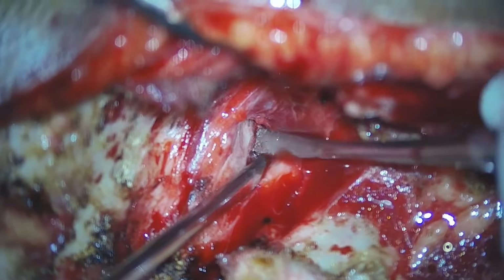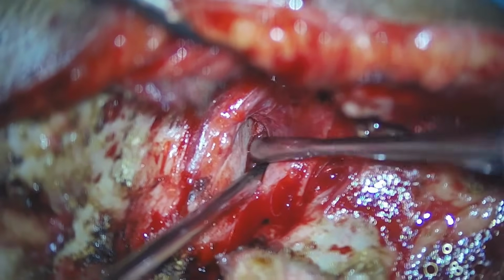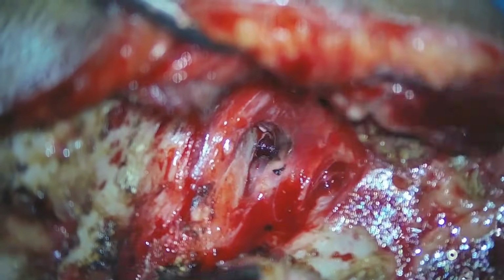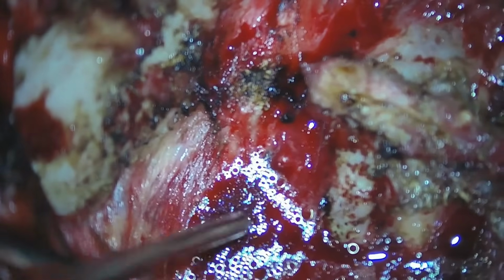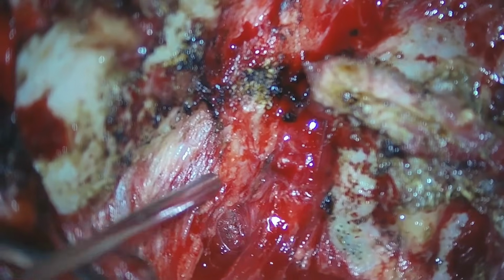Once you encounter any bleed, it is packed with Surgicel and cottonoids and later shifted to the other side. By the time the other side is exposed, there will be hemostasis. We can achieve the hemostasis on one side. This process is repeated till the exposure of C1 lateral mass.